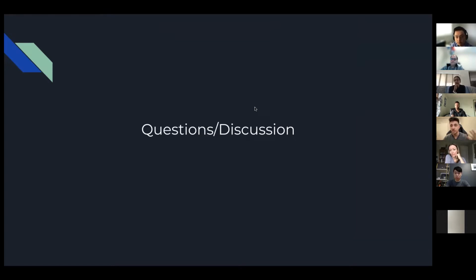Right, same thing like a heart failure patient coming in. Fair enough, you want to give Lasix, but why do they have the heart failure? So in that way, I think VExUS can also be nice. Sometimes we pick up really bad congestion where we don't expect it. Then we do a little bit of digging and we find that they have septal flattening and RV pressure and volume overload. So that's a great point, and something we should probably emphasize a little more: what are the next steps? How do we take these findings on our VExUS study and use them to inform how we use other parts of ultrasound as well?